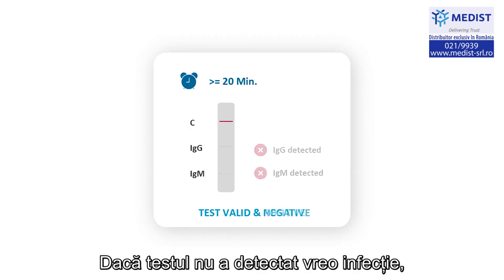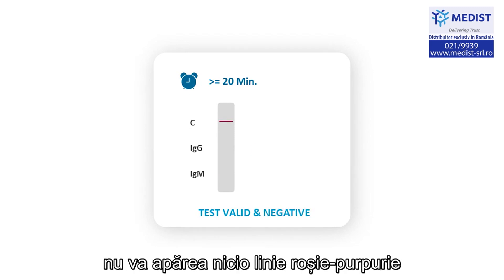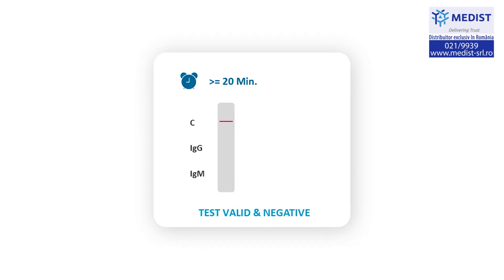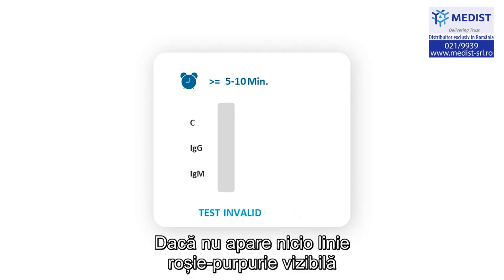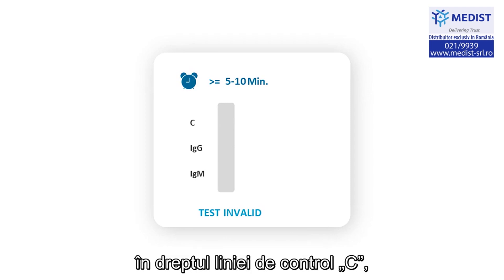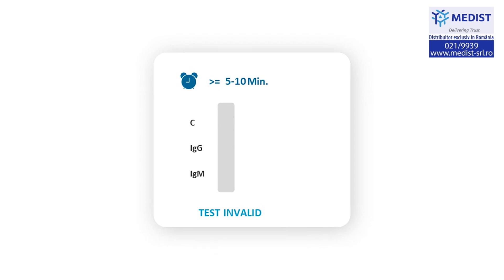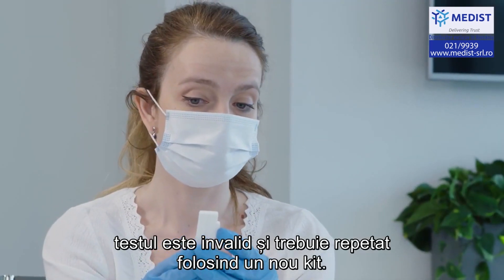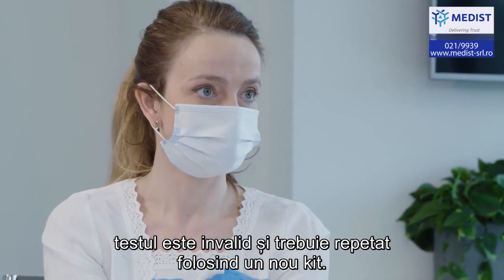If the test has not detected infection, there will be no purplish-red line at either IgM or IgG. If there is no clearly visible purplish-red line at the control line C within the first 5 to 10 minutes, the test is invalid and should be repeated using a new kit.